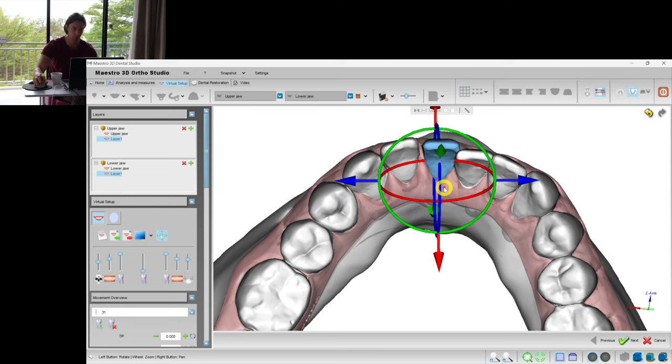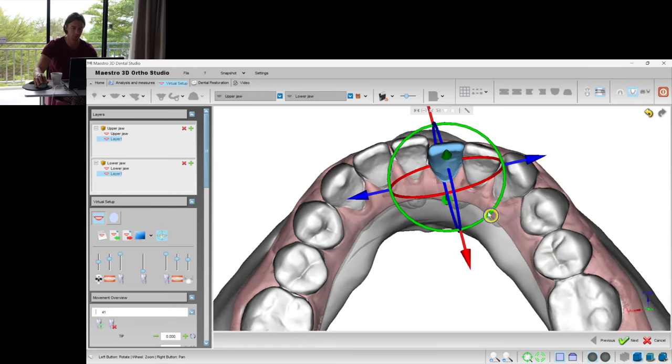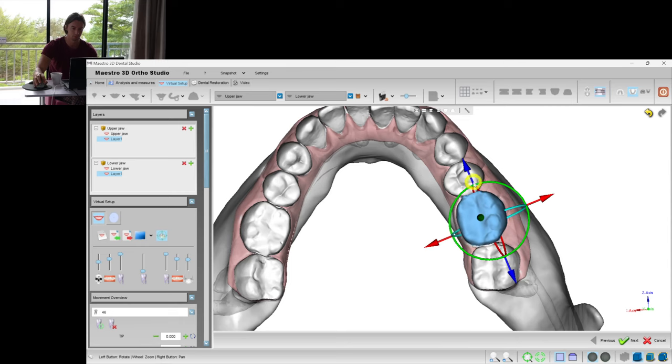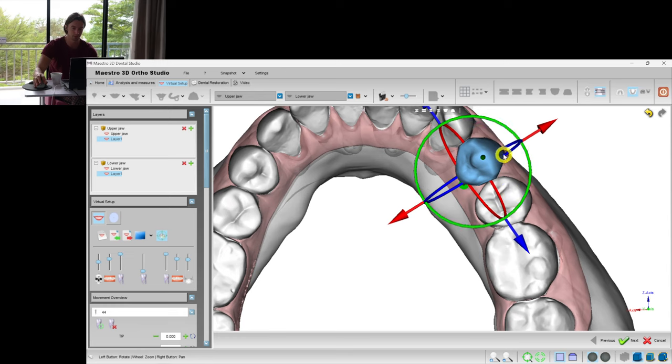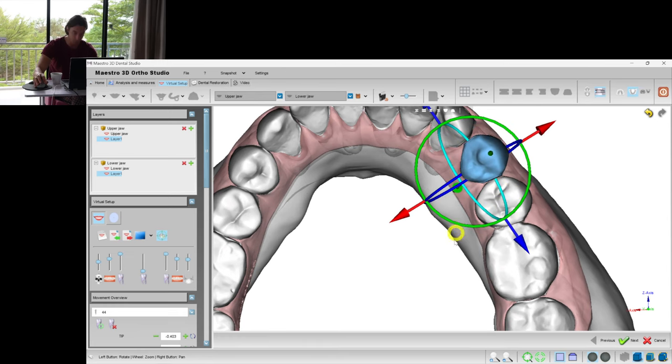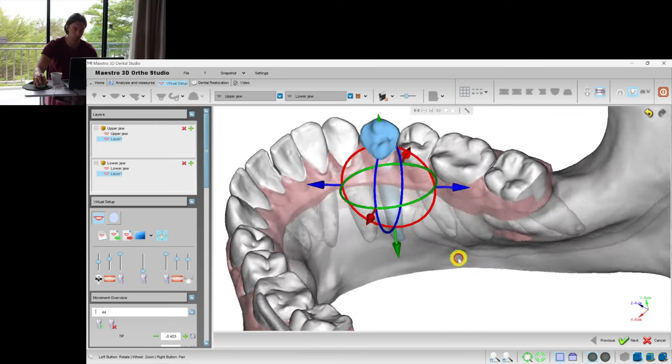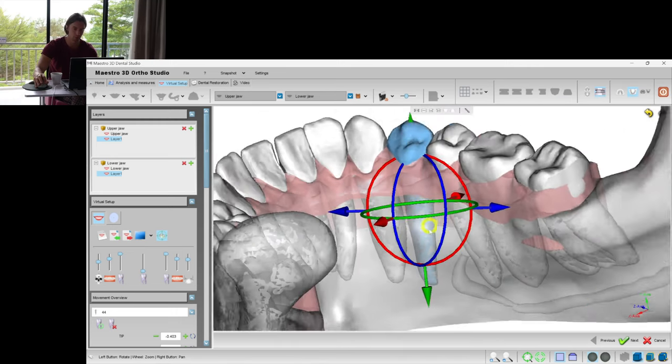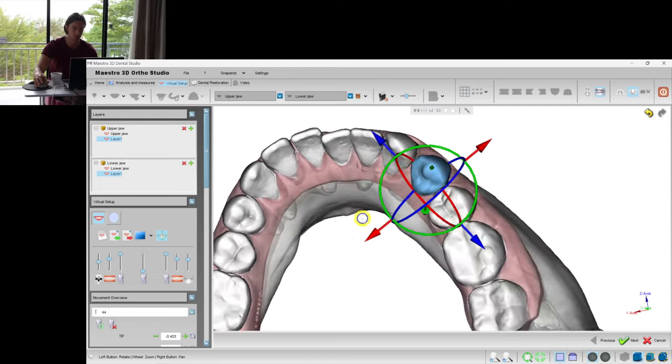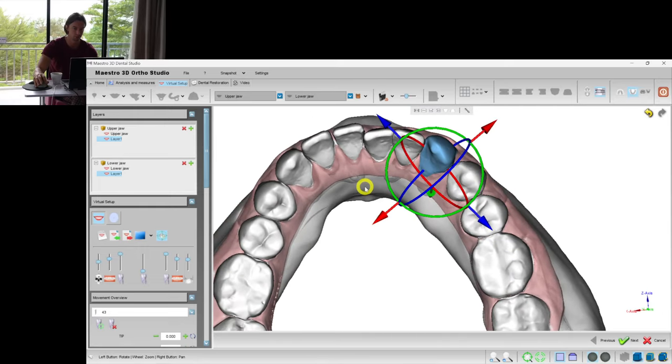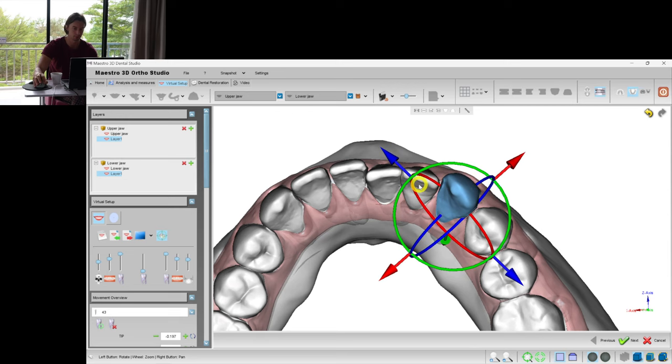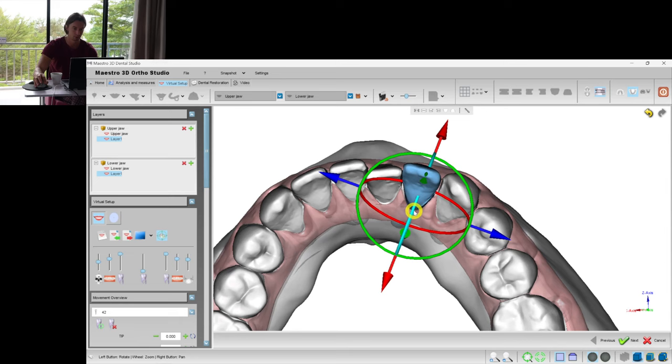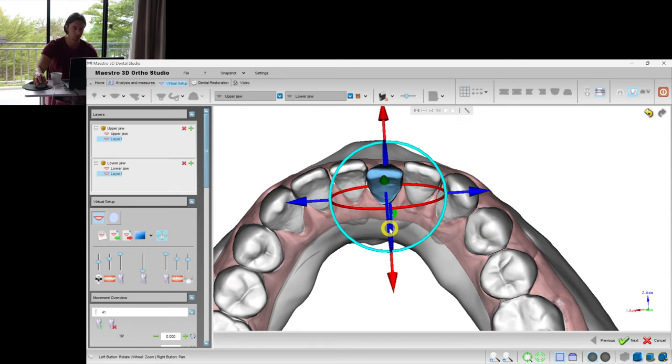We're proclining all the teeth forward. At the stage of preparation of the models, my technician always sets the central rotation in the middle of the root because this is how aligners actually work. They don't move the teeth bodily, so we're limited in translational movements. We use tipping instead of translation in almost all the cases.